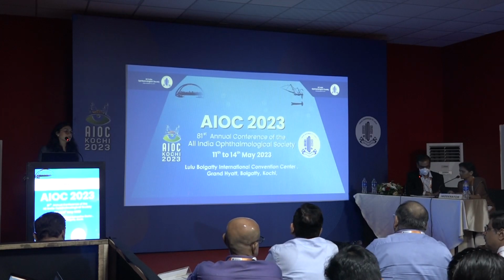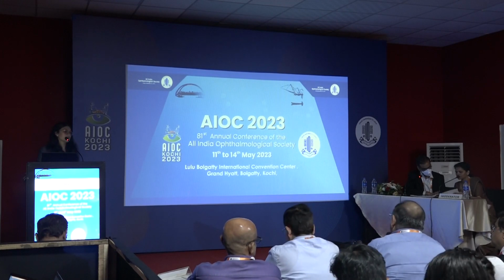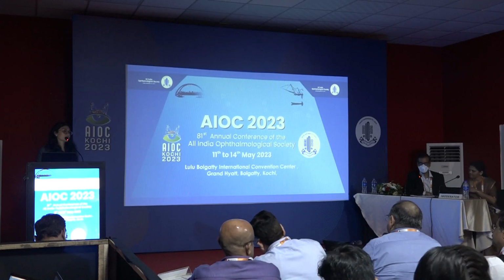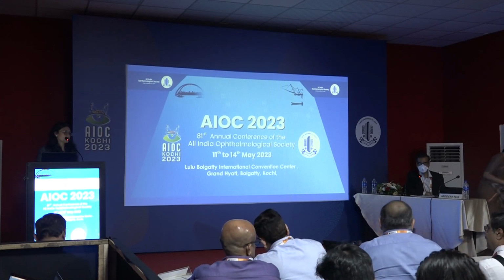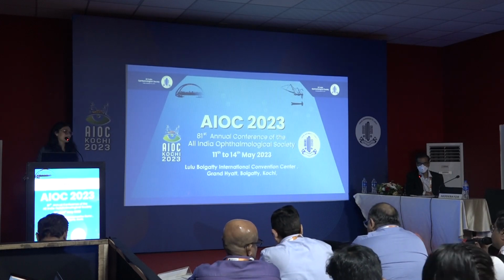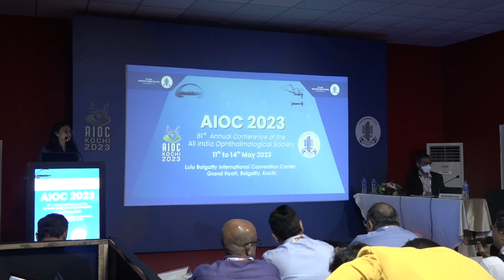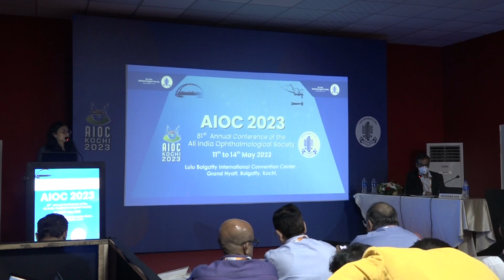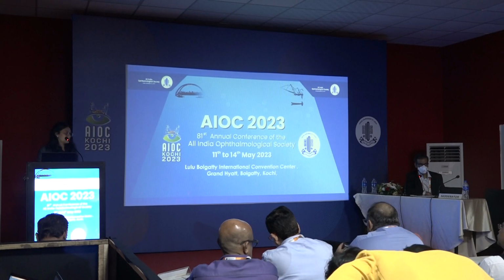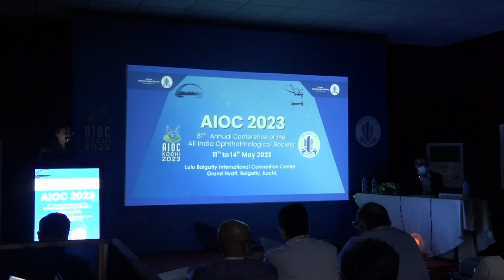In a myopic eye, I would also have my apprehensions on using the transscleral route. Yes. While I feel the retinal route is far safer, there you're creating a retinotomy. Yes. Then you see the unseen through the seen. So probably that might be another option in case the staining works very well. Usually, when we have used brilliant blue dye within the vitreous. Okay. So when you do it subretinally.